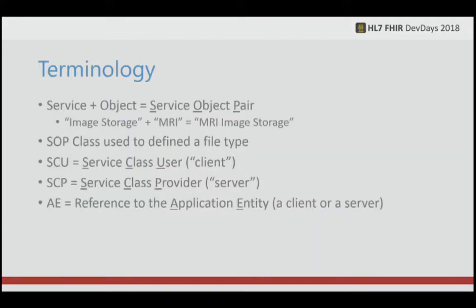We define a service plus an object equals a pair. So a service object pair, which stands for SOP class, which is the actual type of image that's stored on disk. And each player gets its own application entity. Servers and clients will have this.